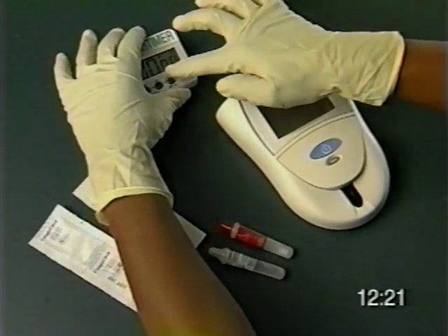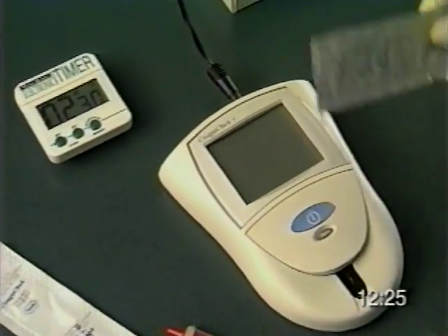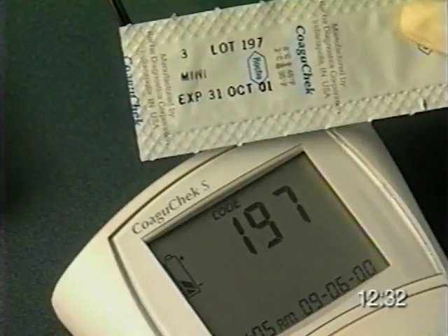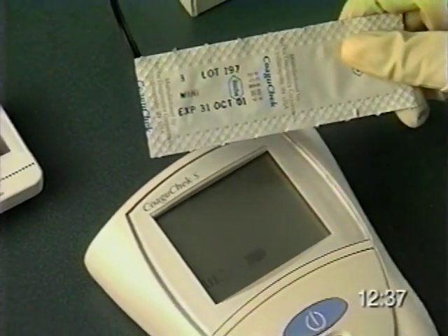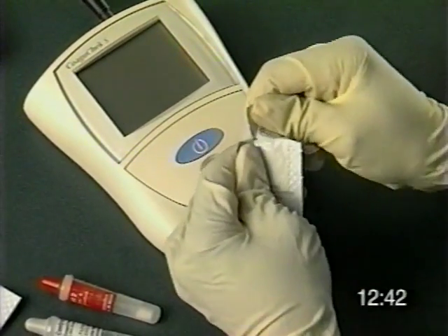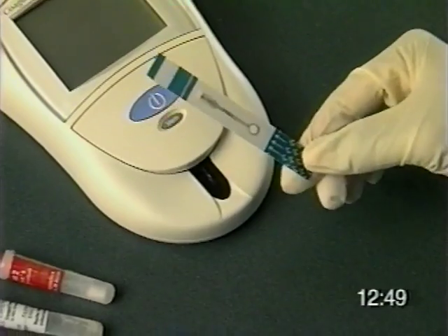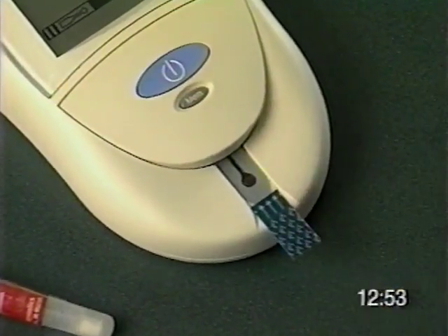When the timer goes off, I turn the monitor on and check to make sure that the code number on the monitor matches the code on the test strip's foil pouch. When the test strip icon flashes on the display, I open up the test strip pouch and remove the strip. Then I insert the strip in the direction of the arrows with the printed side facing up. When I do, a flashing clock icon appears.